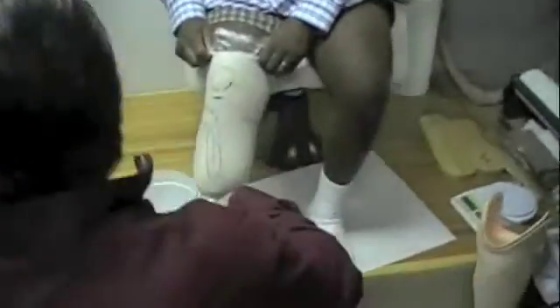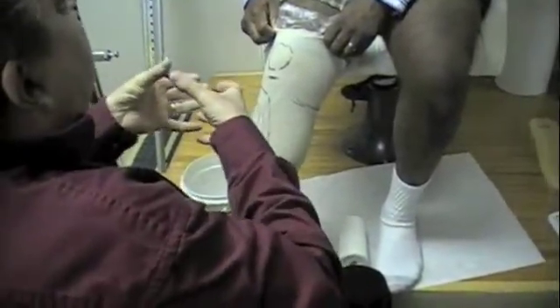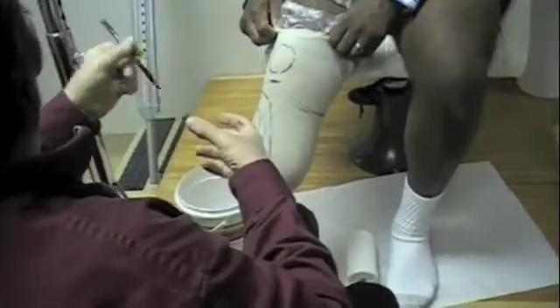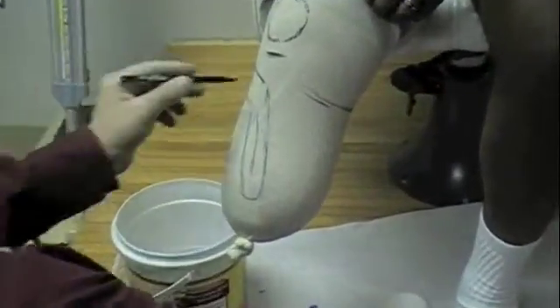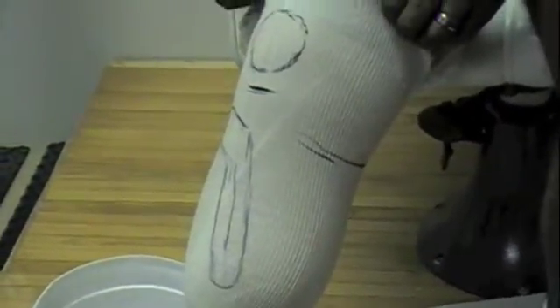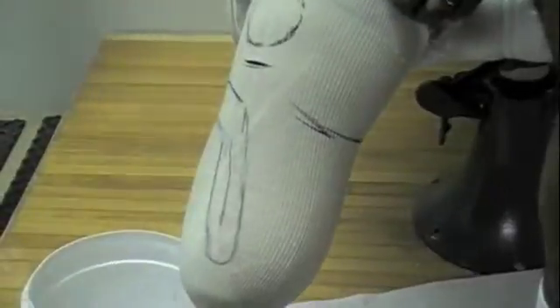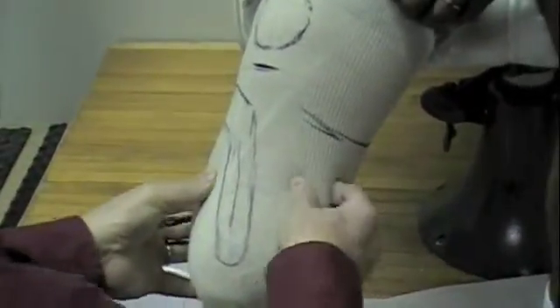When we fill this cast with plaster — because we're going to take a negative wrap now — that's going to be a hollow piece. That's your image, but how do I turn it into a positive? Well, you fill it with plaster, and when you fill it with plaster, the wet plaster will transfer the ink from one side to another. That gives me those references in the plaster model, because once I'm in a hard piece of plaster I can't feel it anymore — it's all hard.